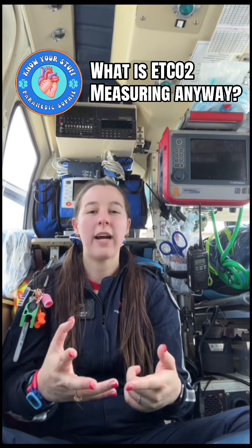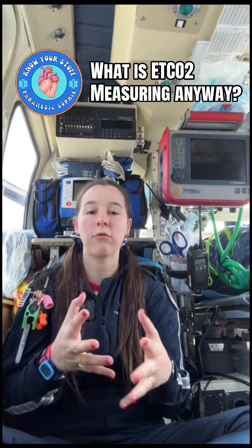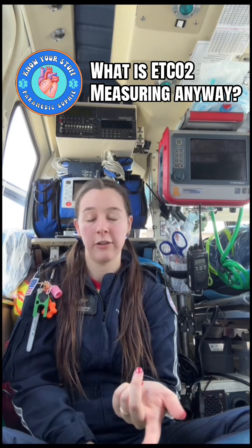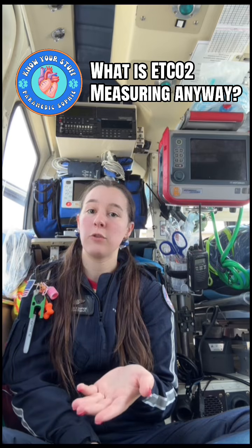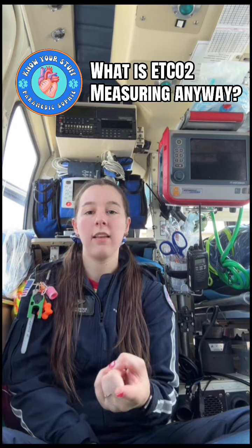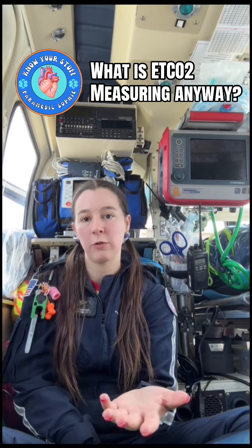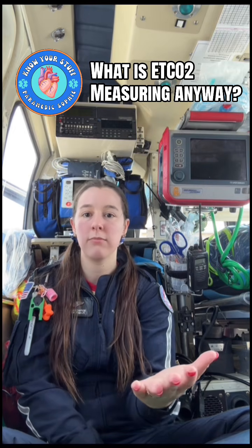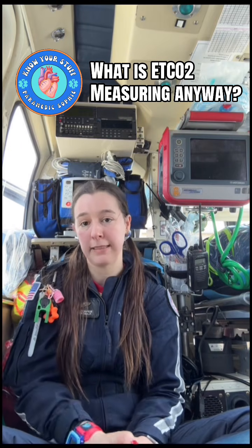That's also why it's useful in cardiac arrest. During CPR, end-tidal gives you kind of that rough idea of perfusion, and a sudden increase in your end-tidal can be one of your earliest indicators for ROSC, because now you actually have circulation delivering CO2 back to the lungs. And then there's airway confirmation, of course. Consistent end-tidal CO2 waveforms means gas exchange is happening in the lungs, which makes it the gold standard. We've all heard that for tube confirmation and placement.